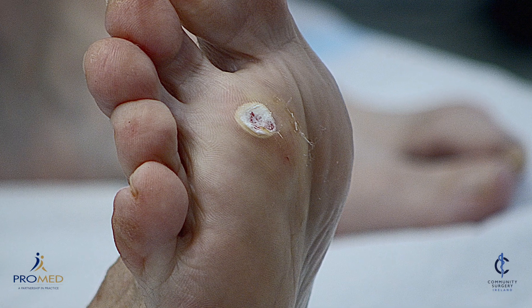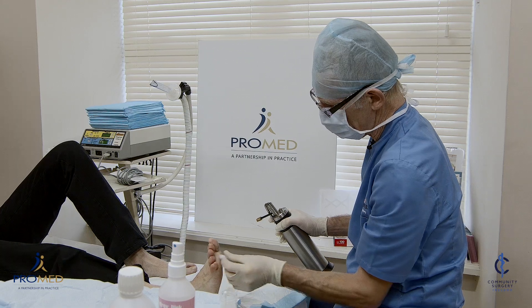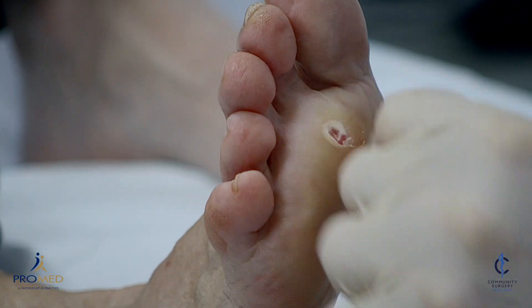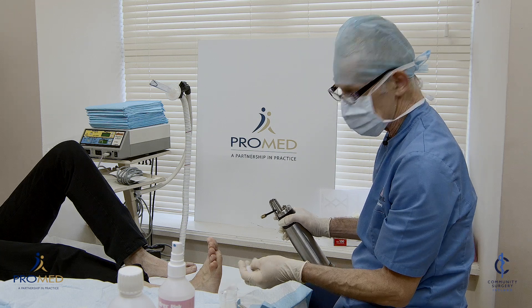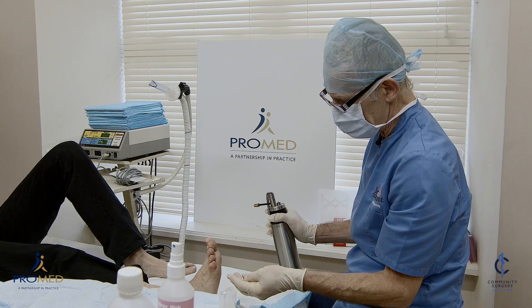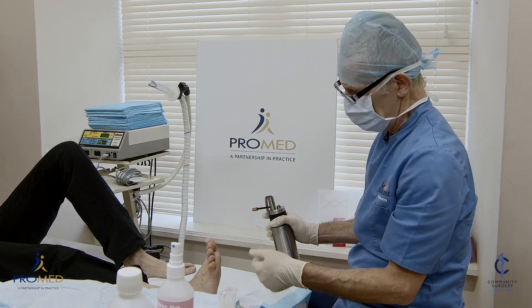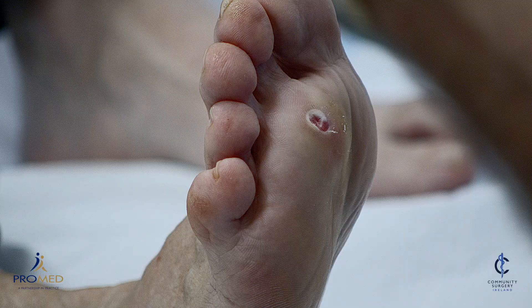Was that sore? No, just stingy — a bit cold? Is it sore now? No. Good. Without anesthetic this would be quite a painful procedure, so it makes it a lot more comfortable for the patient. It makes it a lot easier for the doctor and of course it makes it a lot more successful because we're able to debulk more with the blade. So we're just waiting for it to thaw out.